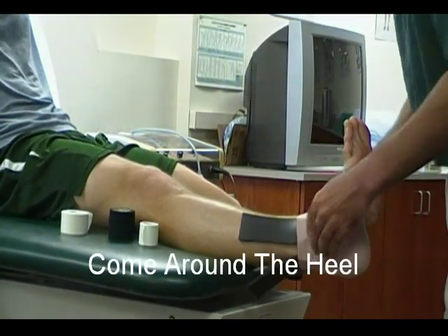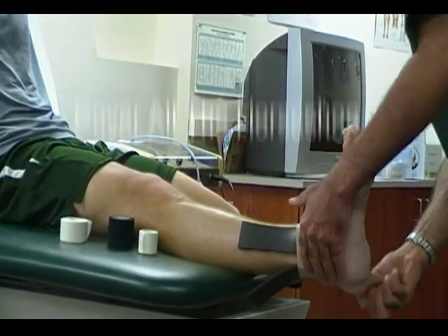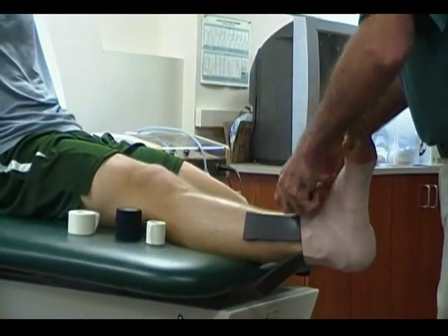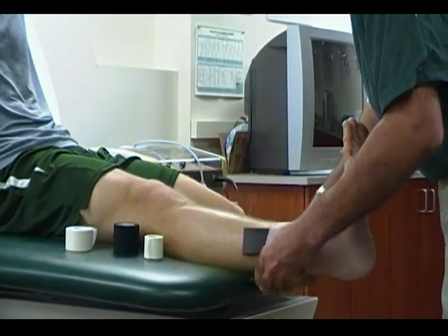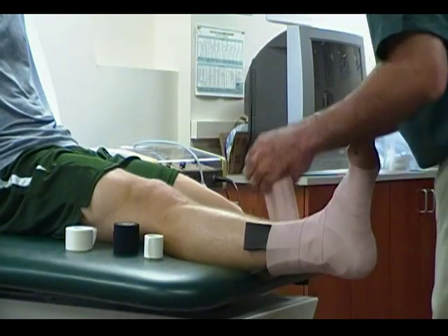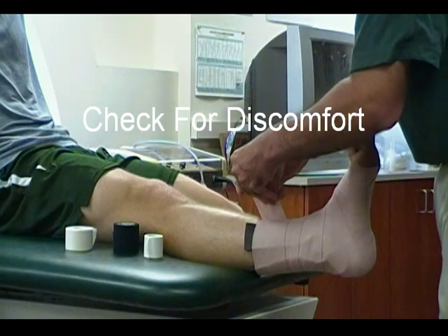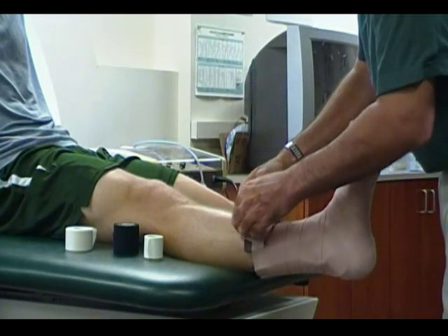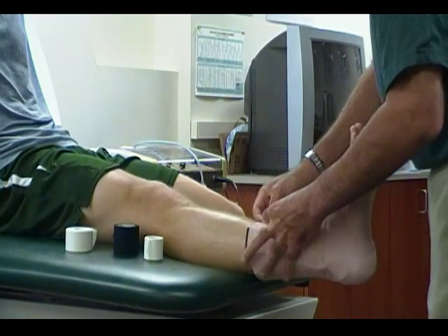Come around the heel, making sure to cover the entire horseshoe and also minimizing any open gaps or windows. Come around the lower leg, making sure you ask the athlete if that is too tight. When you come to the end, just finish on the leg.